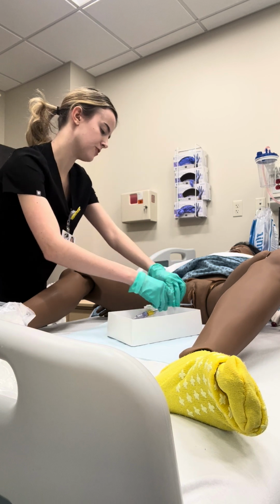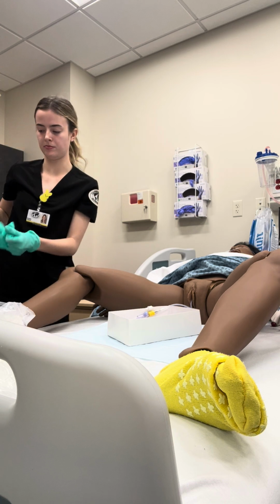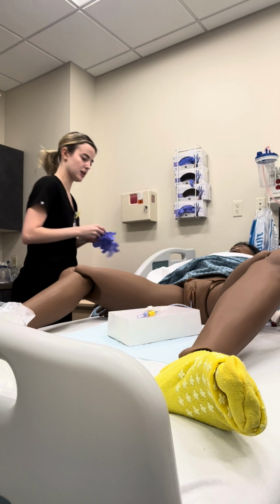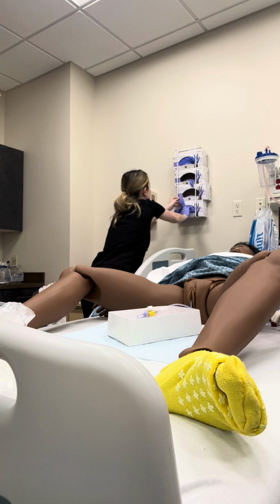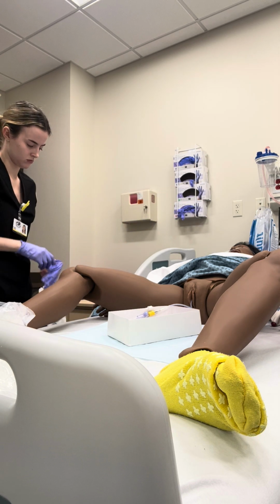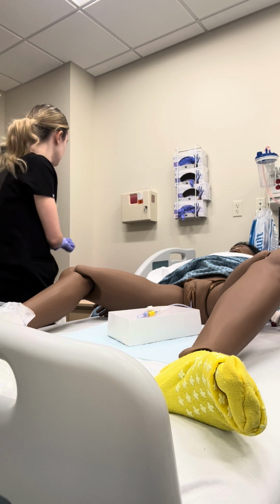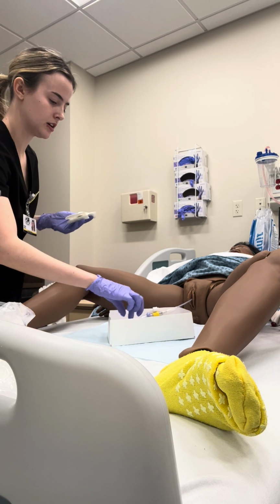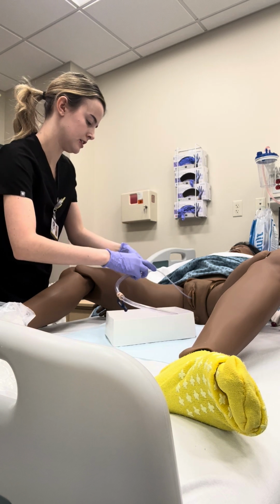Any pain or discomfort? Perfect. So now I will go ahead and remove my gloves and put on a clean pair of gloves. We're almost done. Okay, so then I want to place the stat lock on.